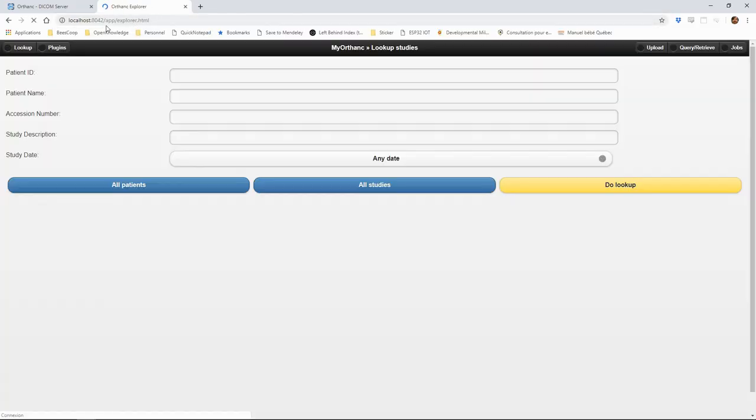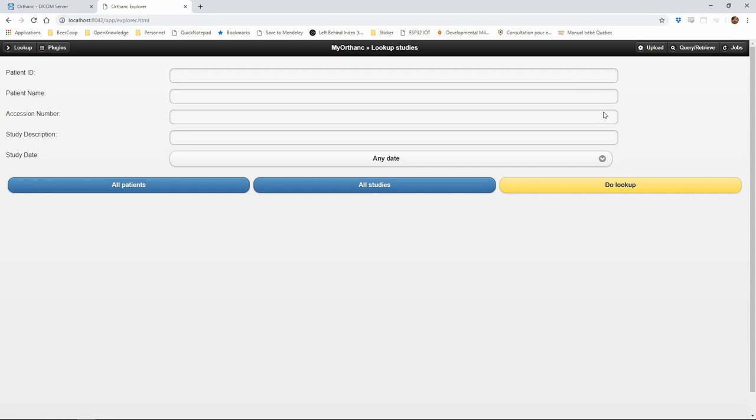We can check that it works by connecting to it with our browser to the port specified for HTTP connections, here 8042. We get to the lookup part of the interface where we can search for patients or studies.